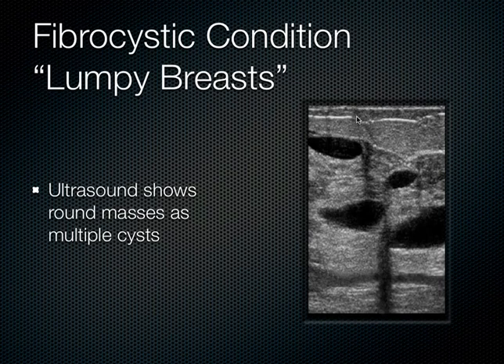The sound is going through the skin and then into this glandular tissue here, and it reaches this cystic structure, and then the sound is redirected. And so it goes through here and then it gets redirected. And on the edges of that cystic structure, we get these lateral shadows. Sometimes we call it lateral cystic shadowing, or refraction artifact. The sound is being redirected. So that's why we see these shadows here on the edges of these cystic structures.